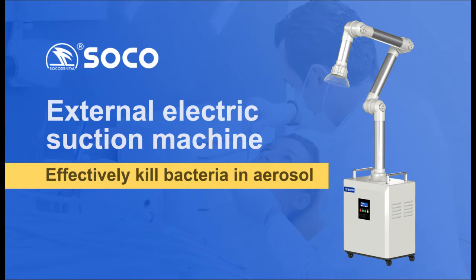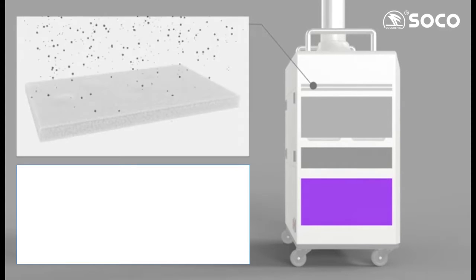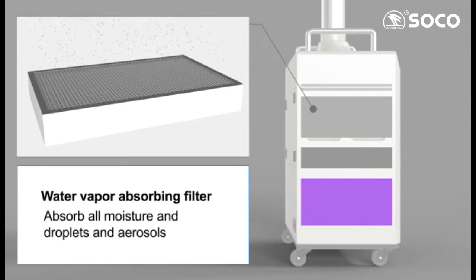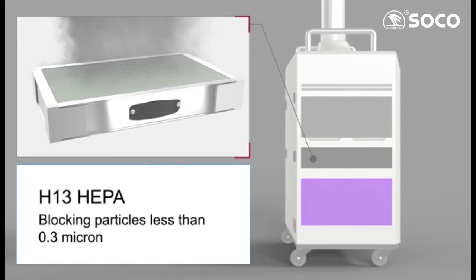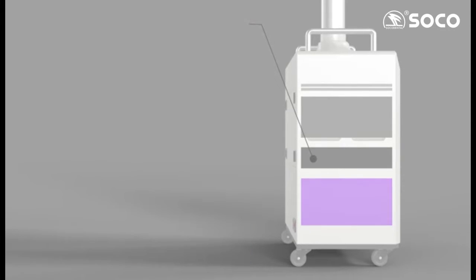SoCo external electric suction machine. Washable primary effective cotton filter: preliminary filter for droplets, aerosols, cutting dust, debris, and blood. Water vapor absorbing filter: absorbs all moisture in droplets and aerosols. H13 HEPA filter: blocks particles less than 0.3 micron. Active carbon filter: absorbs aerosol odor.